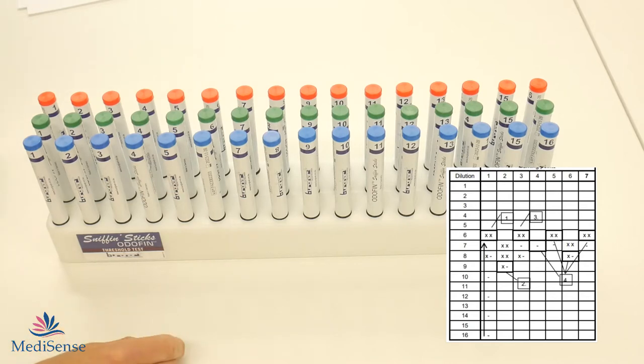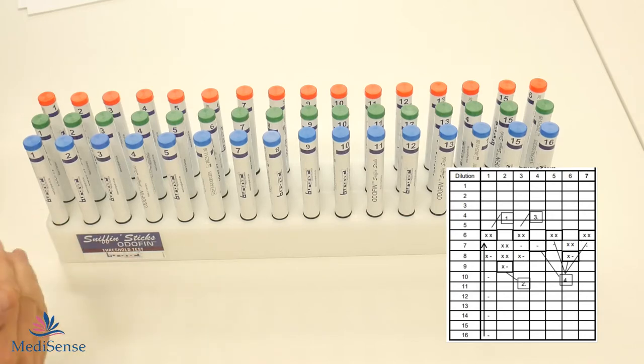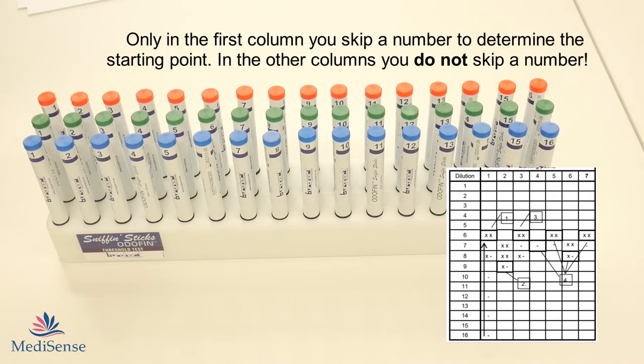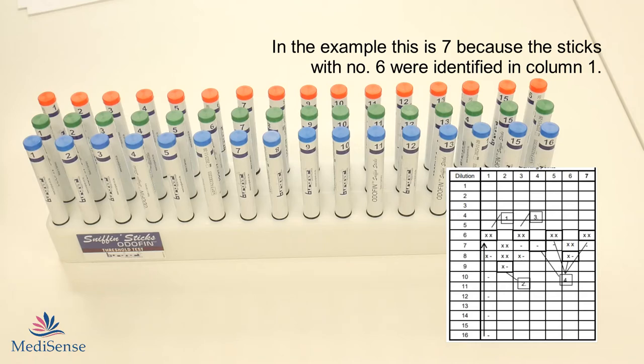Now that you have determined the starting point you go in a different direction. So not higher concentration but lower concentration. And that is in the second row of the scoring sheet. In the example you can see that now you will not skip a number but you will continue with the next lower concentration.